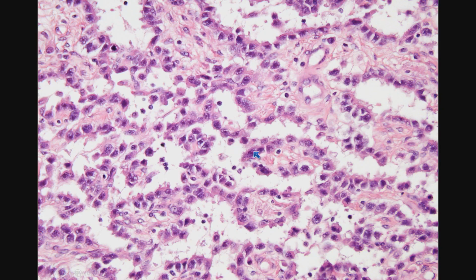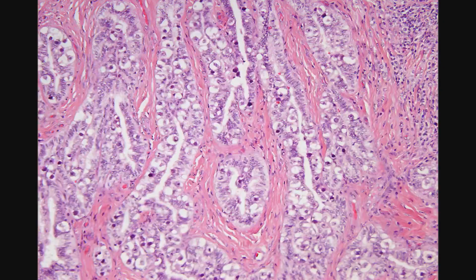Another pitfall in seminoma, sometimes seminomas can be pseudoglandular or alveolar, a pseudoalveolar growth pattern, where they cling on the fibrovascular cores, giving rise to something that looks like it's trying to make primitive glandular structures. Again, the cells still look like seminoma, and they're not truly a tubular formation.